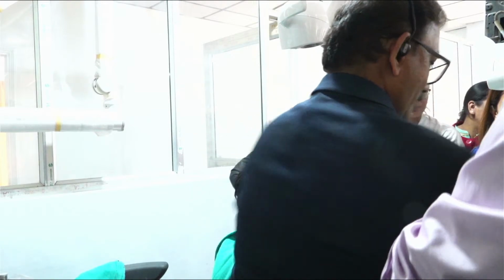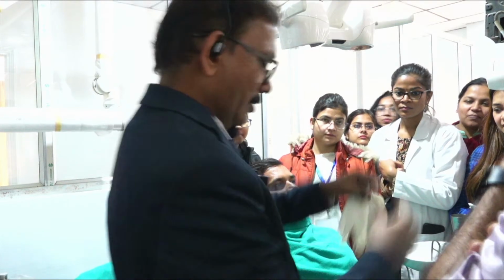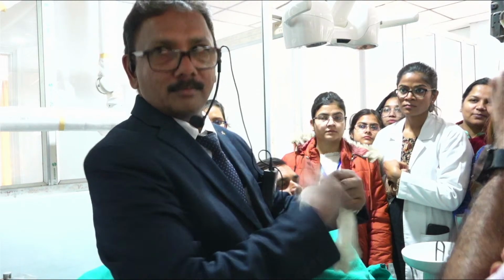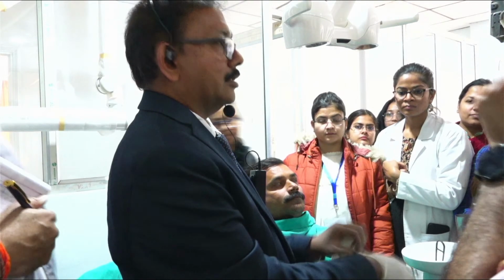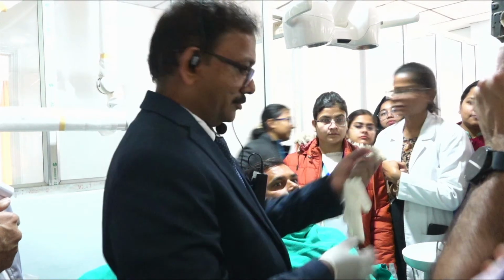Stains were removed since yesterday. Exactly. Immediately after polishing, only then you have to do it, it is more effective. If you leave 24 hours, again there will be stains.